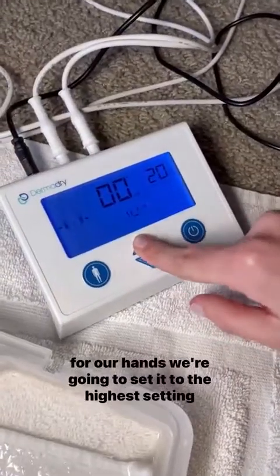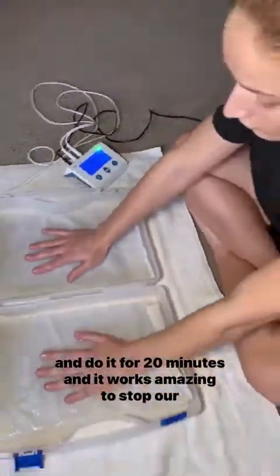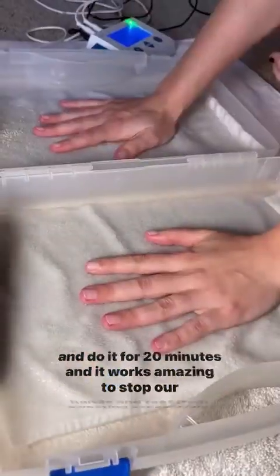And for our hands, we're going to set it to the highest setting and do it for 20 minutes. And it works amazingly to stop our hands and feet from sweating excessively.